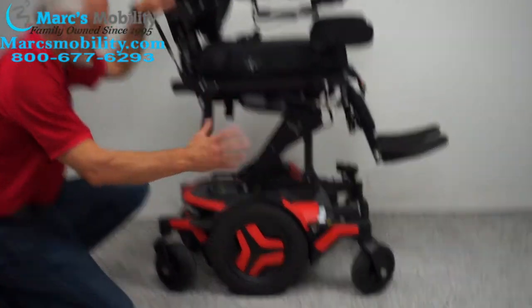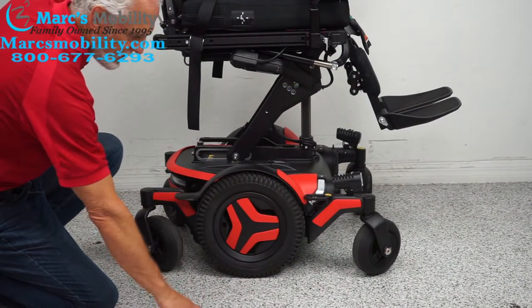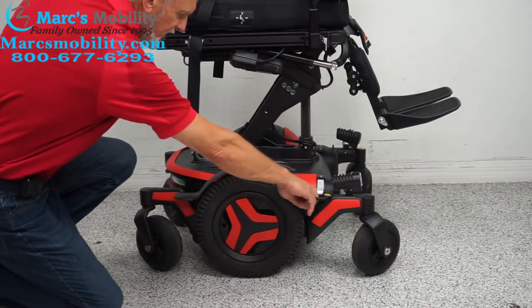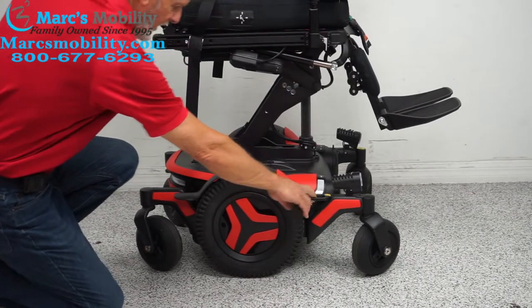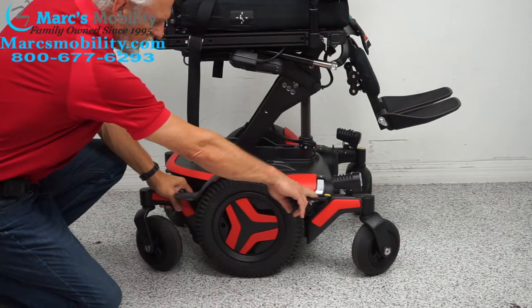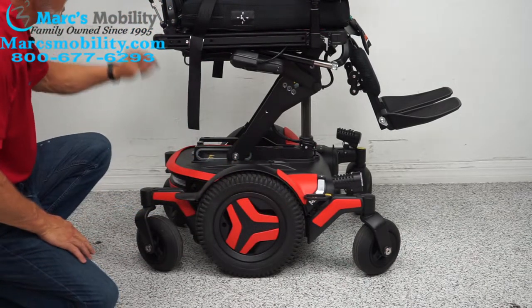While the seat is up, let's look at the base. We have 14-inch solid tires — they're not going to mark your floor. There are castor wheels in the back and castor wheels in the front. You can see there are anchor points welded to the frame — two on this side and two on the opposite side. This is where you secure your chair if you're going to transport it.